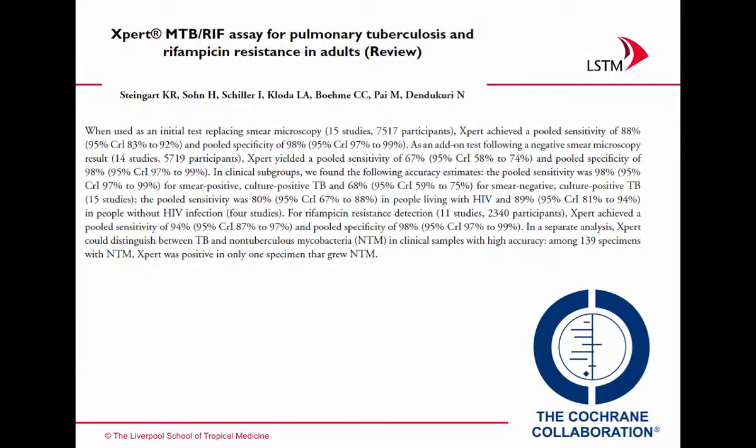The Cochrane Collaboration for Infectious Diseases is housed at LSTM, and they've recently produced a systematic review so that GeneXpert could go to the WHO STAG committee, where it was endorsed a couple of years ago, and they can roll out this diagnostic tool. And I won't go through all of this. This is the abstract for the systematic review. But the thing to note is that with smear-positive TB cases, GeneXpert is about 98% sensitive, and more importantly, with smear-negative patients, it's about 70% sensitive.